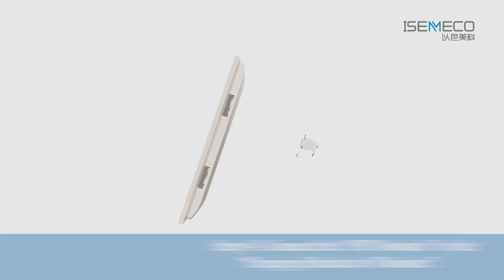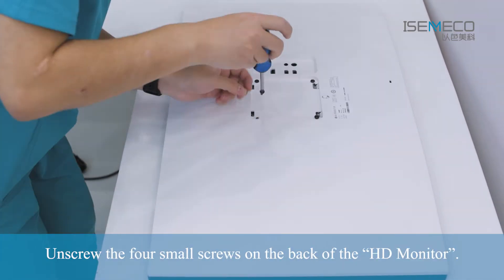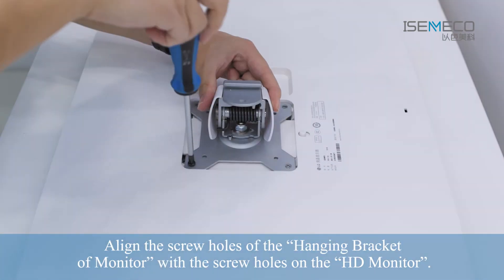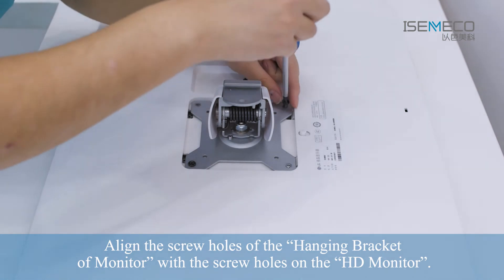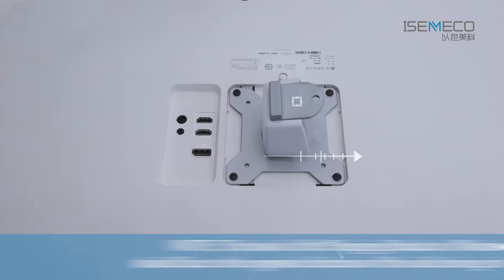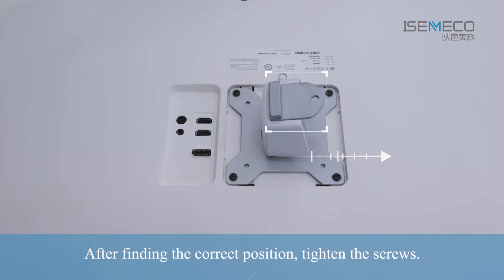Step 4: Connect the A-HD Monitor to the Hanging Bracket of Monitor. Unscrew the four small screws on the back of the A-HD Monitor. Align the screw holes of the Hanging Bracket of Monitor with the screw holes on the A-HD Monitor. Note: the hook of the Hanging Bracket of Monitor should face the opposite direction of the side having interfaces. After finding the correct position, tighten the screws.